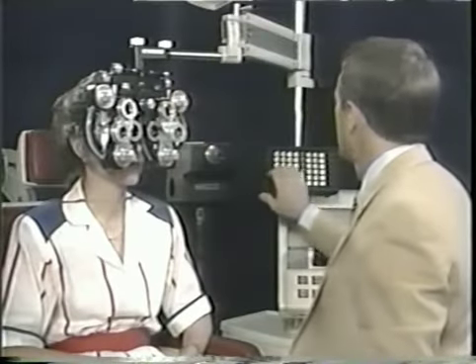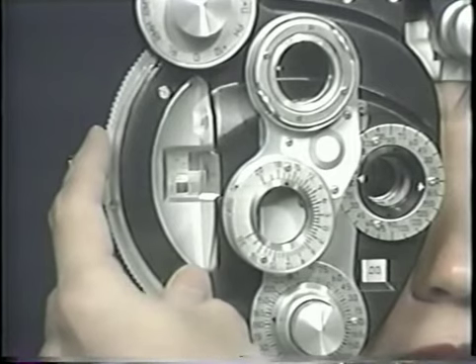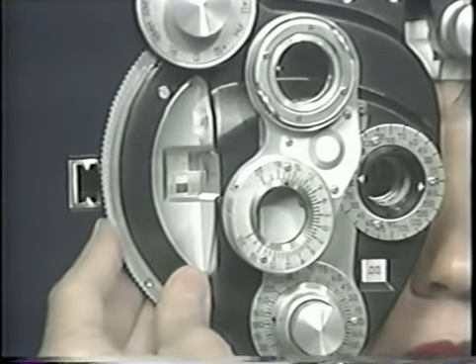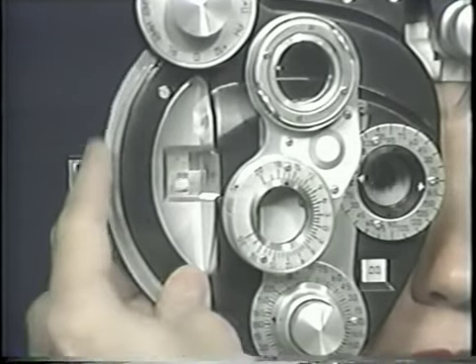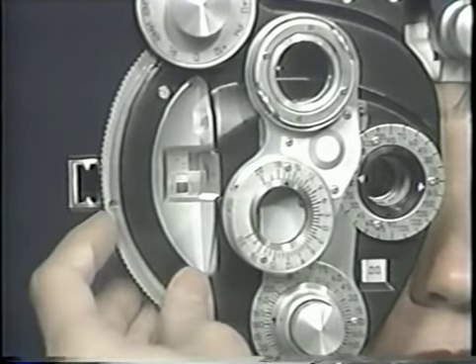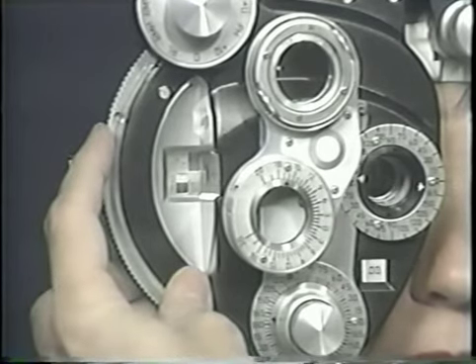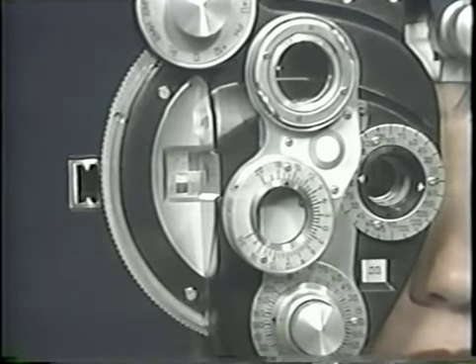If the response to the first change in the plus direction is worse, the change is not only canceled, but testing is then performed in the minus direction. Let's listen to the proper instructions. Now, watch closely. I'm going to change it. Does this make it better or worse? Ready? There. That's worse. Okay, now I'm going in the other direction. Does this make it better or just smaller and darker? Ready? There. Better. Good. Can you read farther down on the chart?